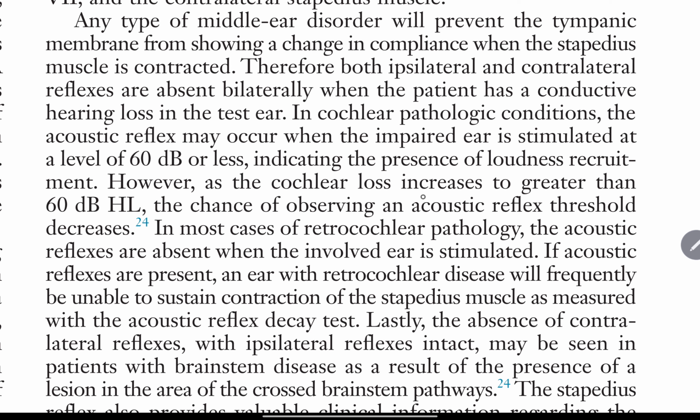However, as the cochlear loss increases to greater than 60 decibels hearing loss, the chance of observing an acoustic reflex threshold decreases. In most cases of retrocochlear pathology, the acoustic reflexes are absent when the involved ear is stimulated. If acoustic reflexes are present, an ear with retrocochlear disease will frequently be unable to sustain contraction of the stapedius muscle as measured with the acoustic reflex decay test.